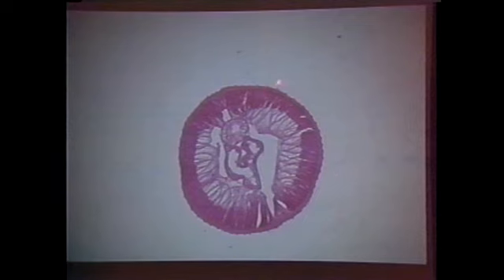And then, if you have evenly spaced little teats on every section, you've got to think to yourself, well, if they're sticking out this way, they're running the length of the worm. All right? And so when you describe them to your contributor, they are called external, because they're on the outside, cuticular, because they're made of cuticle, longitudinal, because they're longitudinal ridges. External longitudinal cuticular ridges. That's what you tell him.